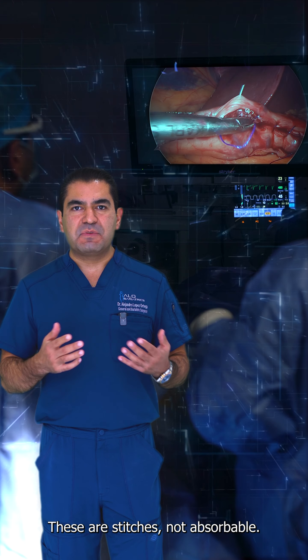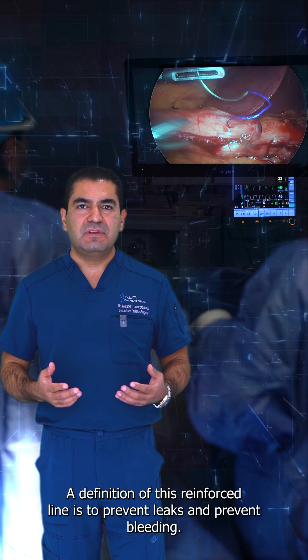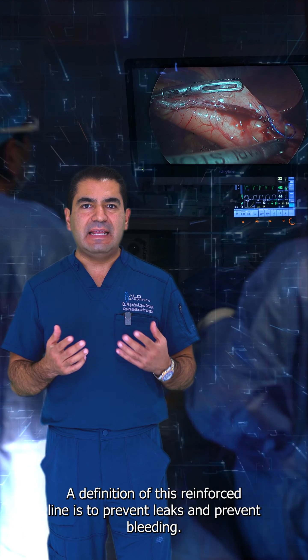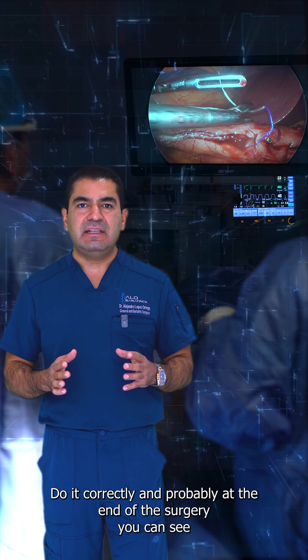These stitches are not absorbable. The function of this reinforced line is to prevent leaks and prevent bleeding, so it's very important to do it correctly.